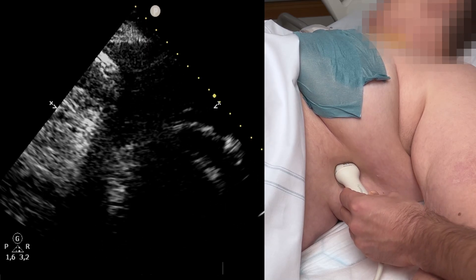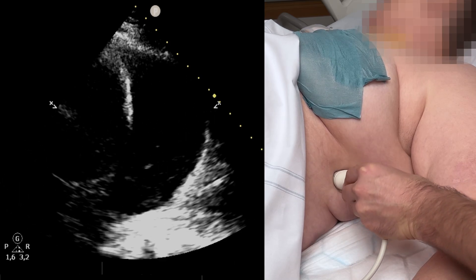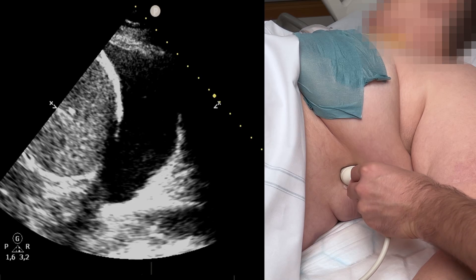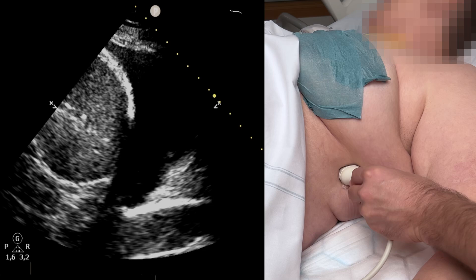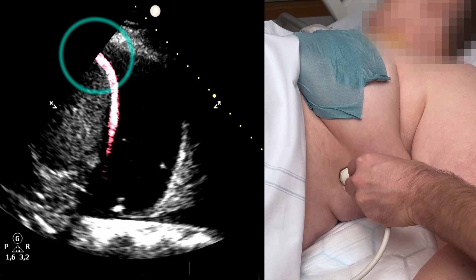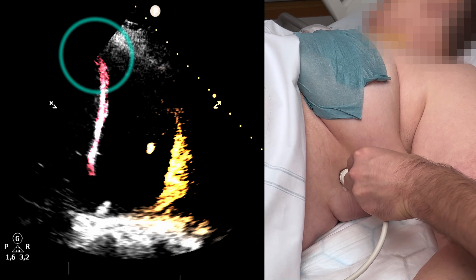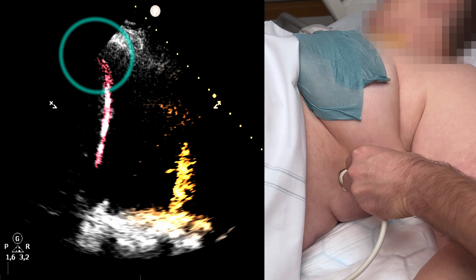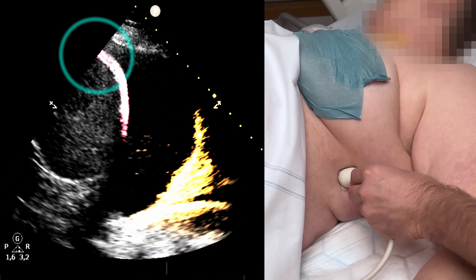A cardiac or abdominal probe offers an excellent overview. Place it in the mid-axillary line at the level of the nipple, with the ultrasound beam in a cranial to caudal orientation. Trace along the mid-axillary line and locate the point where the diaphragm meets the thoracic wall. Note the waving lung tissue. If you see kidney, spleen, or liver, you're too caudal. If you see only lung or a large black void, then you're too cranial.